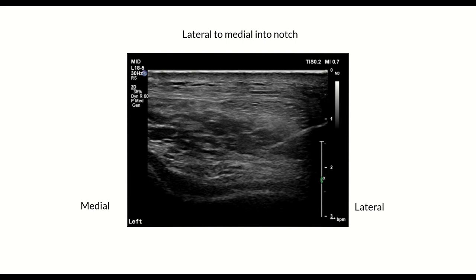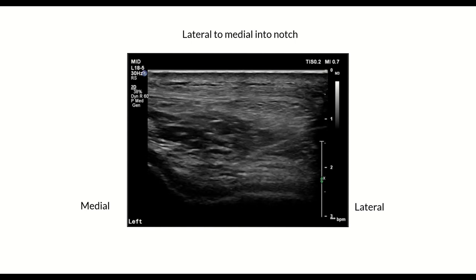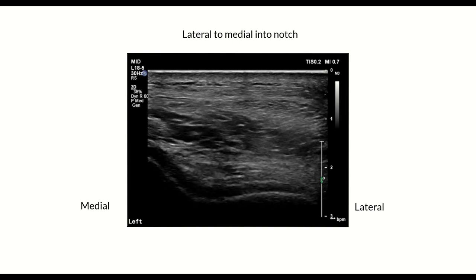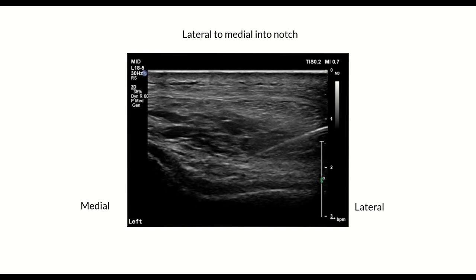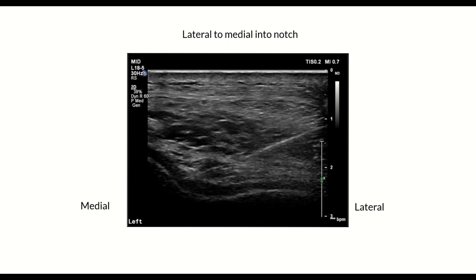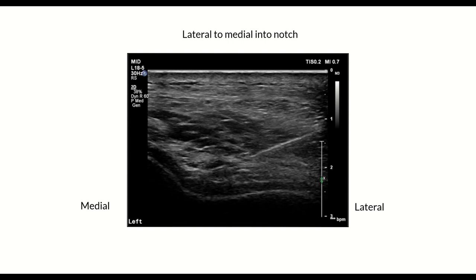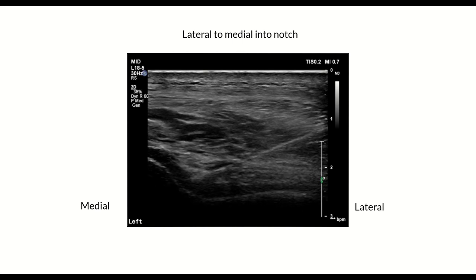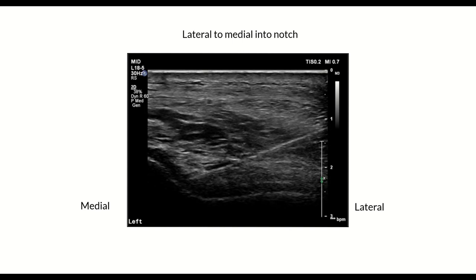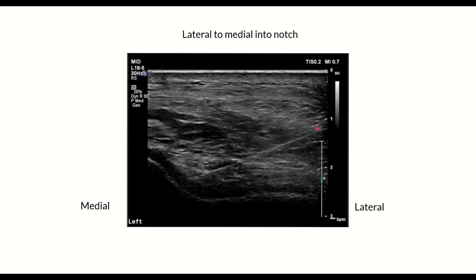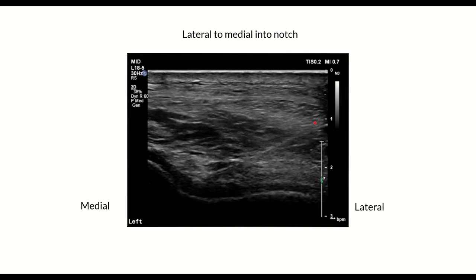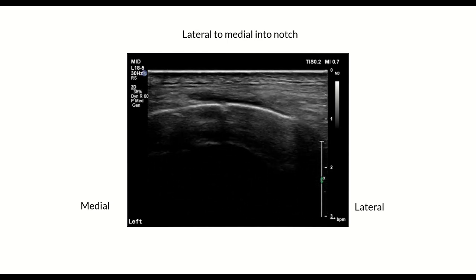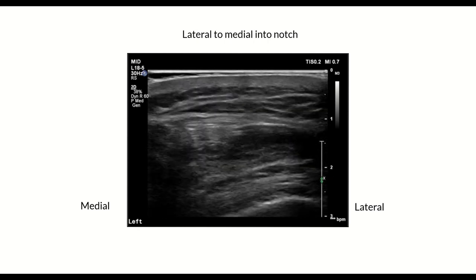As an aside, I wanted to show the lateral to medial approach with this technique. The needle is in-plane and we're injecting just deep to the fat pad itself — the only difference is the side you're approaching from. The reason I prefer the medial approach is that the tendon is a little closer to the needle path from the lateral side, making it more difficult to avoid, as opposed to going through the skin and synovial capsule using a medial approach.